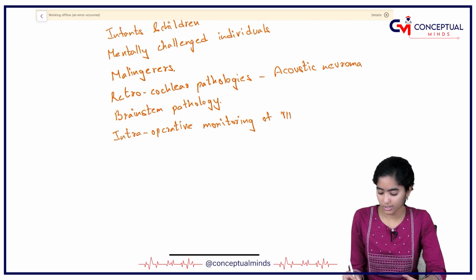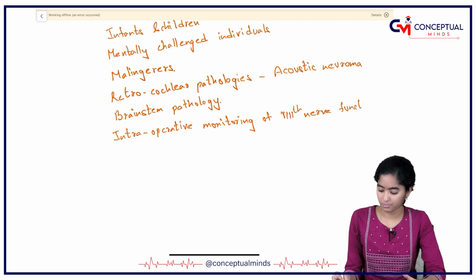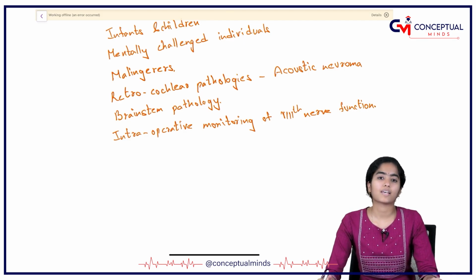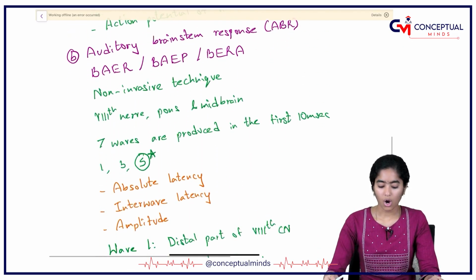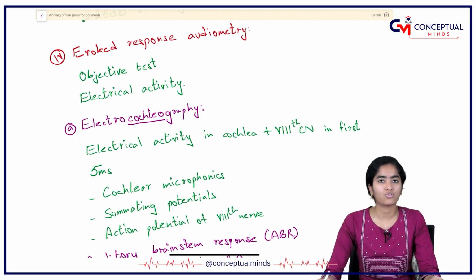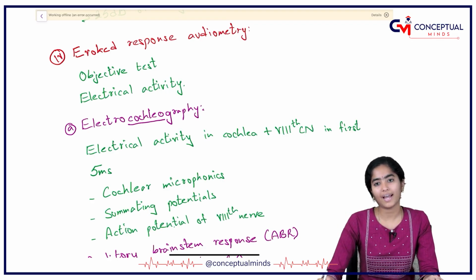As I earlier told, this test can be performed even in sedated patients. So it's not a problem, even if the patient is anesthetized. So this is about BERA, Brainstem Evoked Response Audiometry. With this I complete Evoked Response Audiometry and the two important tests under this category, electrocochleography and BERA.